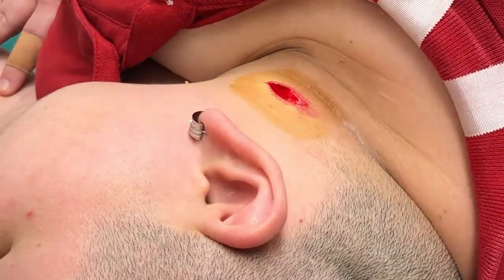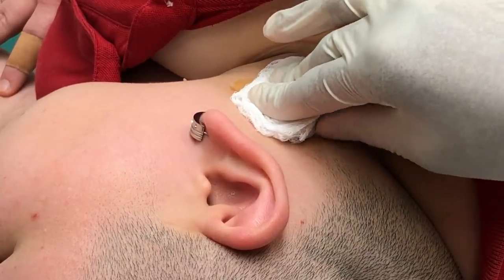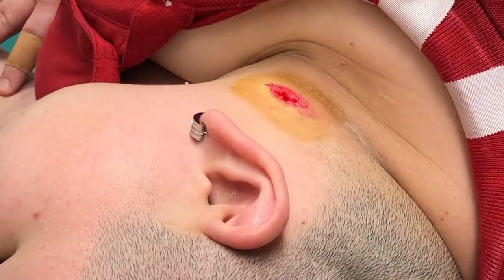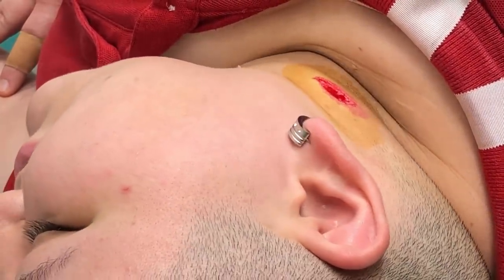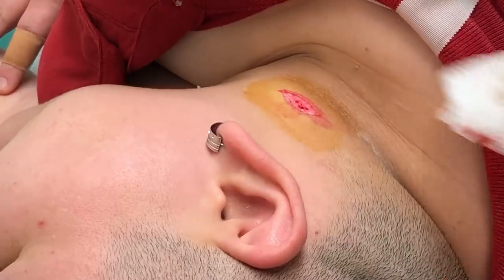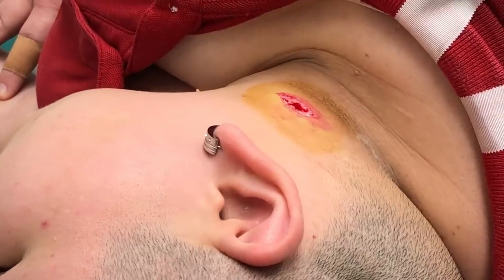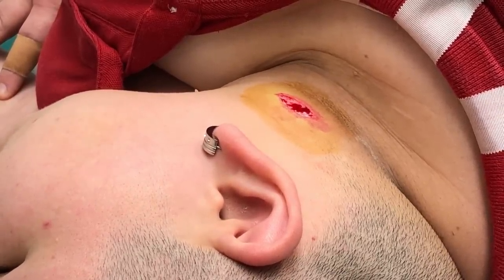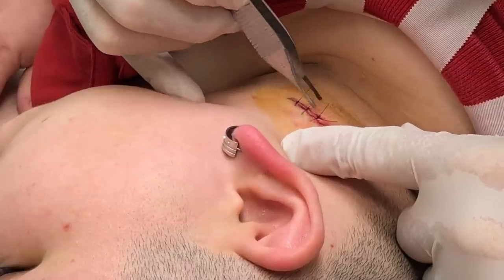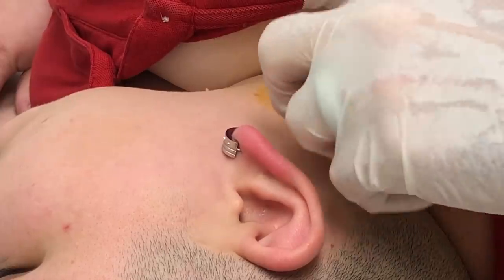Just a little bit more. Go ahead and dab that before it grips on her. So, you want to see what it looks like? Oh my God. So that's what it looked like. I feel confident that we got the whole thing. That looks really good. We'll put some stitches in here. Let's be sure we send this off to Pathology, Gummy Jean, please. The stitches knots are all on the same side of the wound there. Just a little dressing, Gummy Jean.